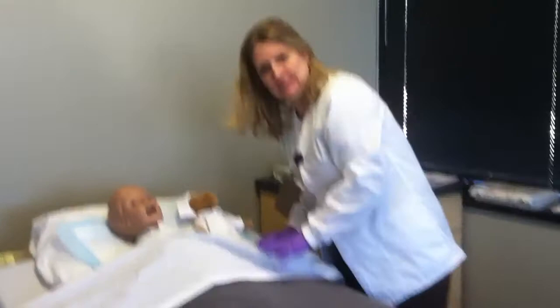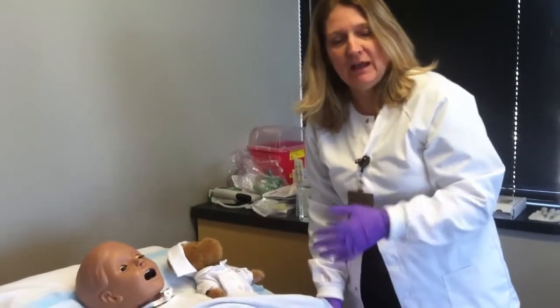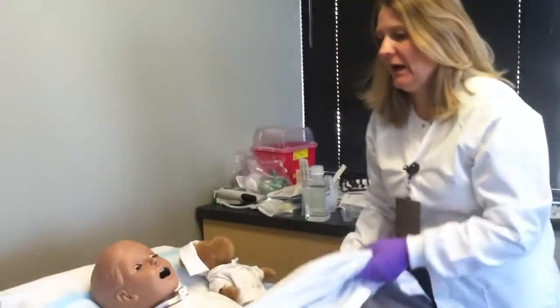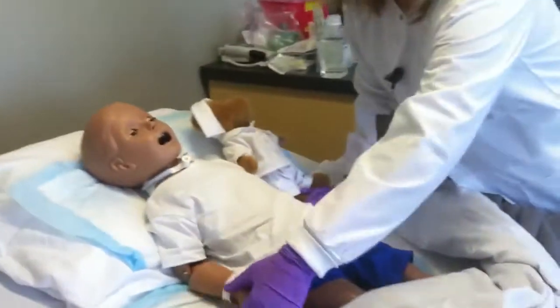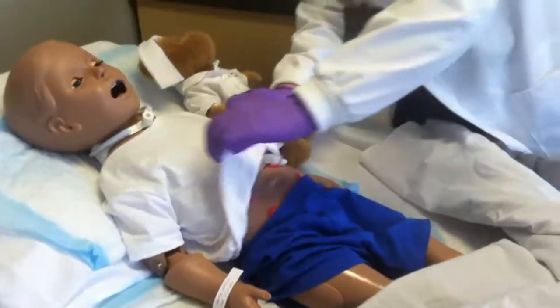We're going to see little Danny, and I want you to talk to him as if he's your patient, and you're going to be telling him what he's going to have done to him. He's only 15 months old, so I would just say, okay, I'm going to clean that little tube on your tummy, okay, Danny? We're going to check for his ID band, make sure that this is the right patient.